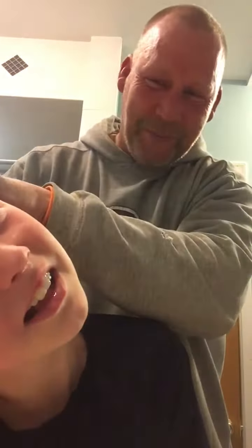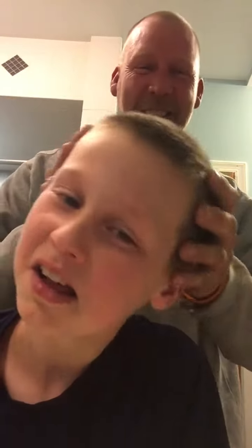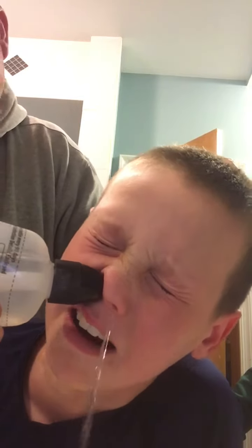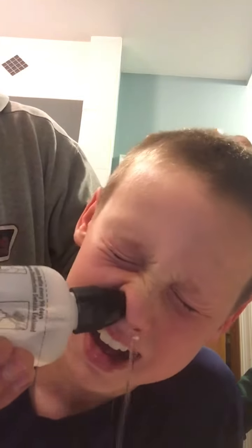Okay, turn your head this way. Now we're going to put it up the other nostril. Okay, here buddy.